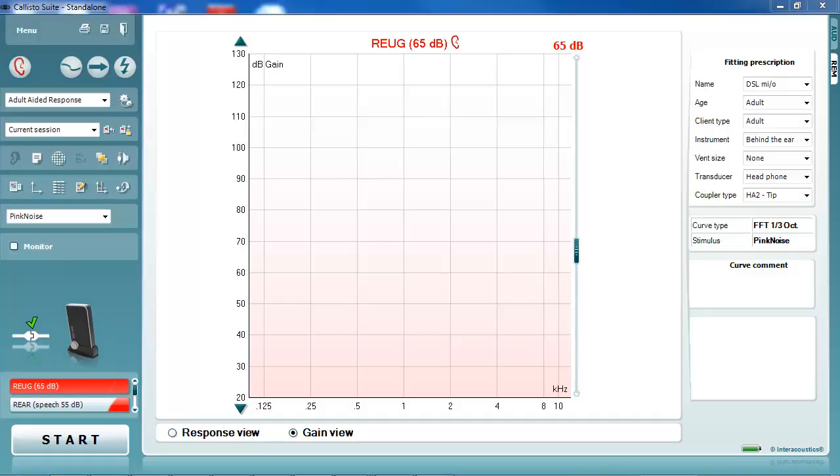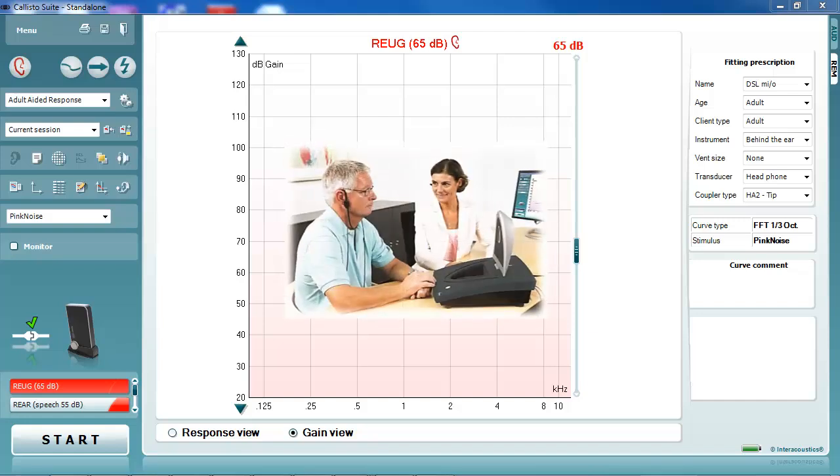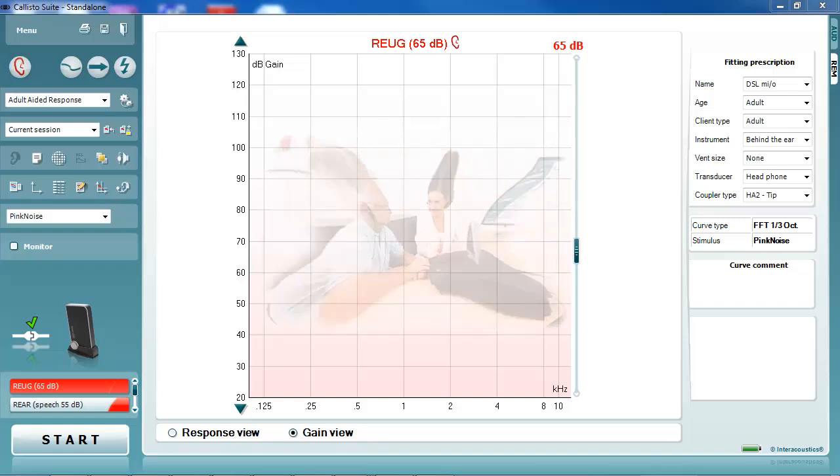When performing REM, the stimulus intensity needs to be maintained at the point of the patient's head to ensure an accurate measurement is made.